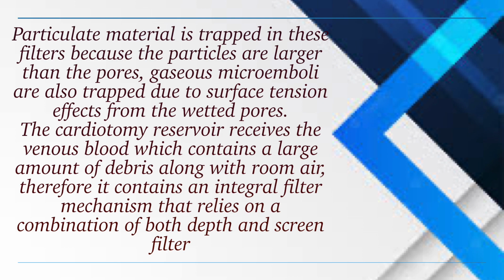Particulate material is trapped in these filters because the particles are larger than the pores. Gaseous microemboli are also trapped due to surface tension effects from the wetted pores. The cardiotomy reservoir receives the venous blood, which contains a large amount of debris along with room air. Therefore, it contains an internal filter mechanism that relies on a combination of the depth and screen filters.